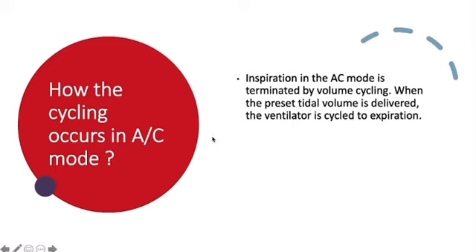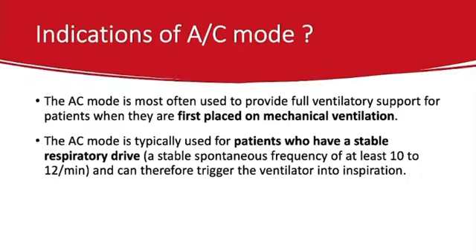How does cycling occur in AC mode? Inspiration in the AC mode is terminated by volume cycling. When the preset tidal volume is delivered, the ventilator is cycled to expiration.